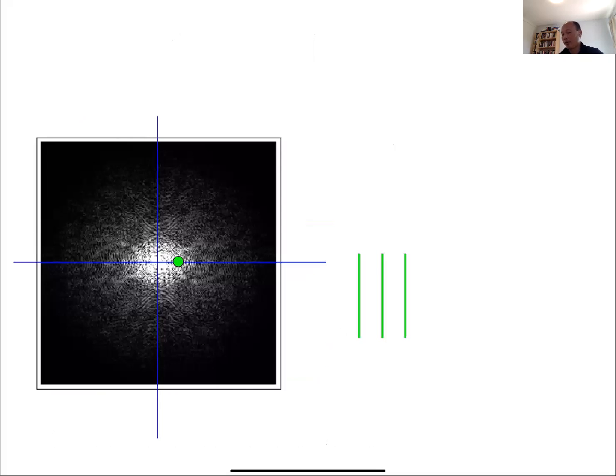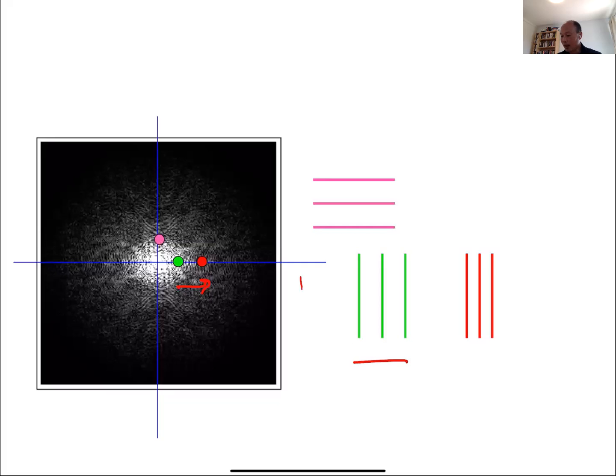Okay, so let's quickly go through this example of moving through K-space. So this green dot here shows you one point in K-space, and it might have this sort of spatial pattern. As I move out farther in K-space, you notice the farther I move out along the x-axis, the spatial period gets smaller because I'm going to a higher frequency. If I look at some place along the ky axis, so this is kx and ky, then you notice now we have spatial frequencies moving in that direction.